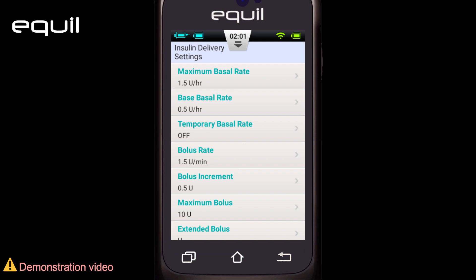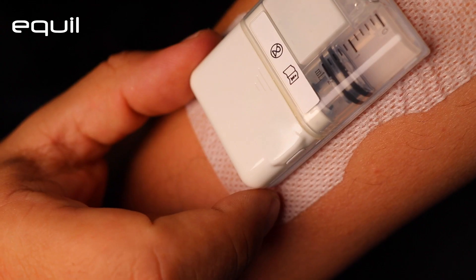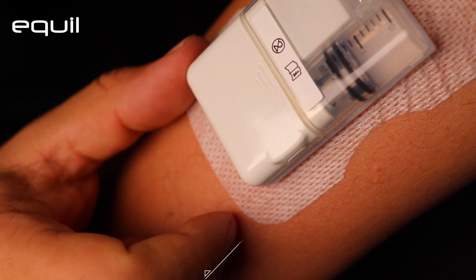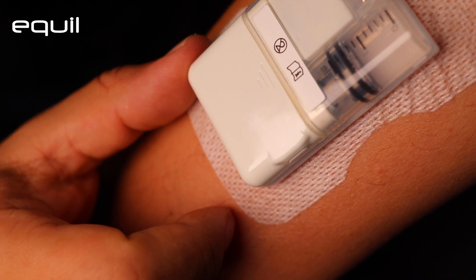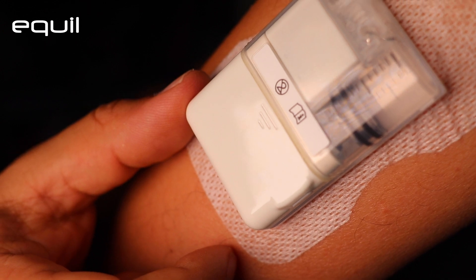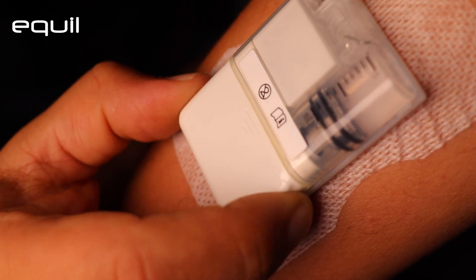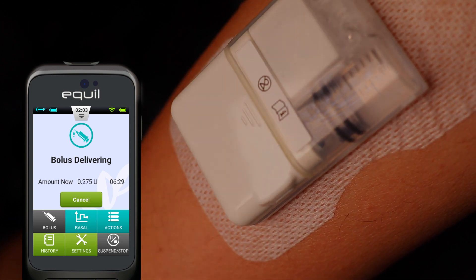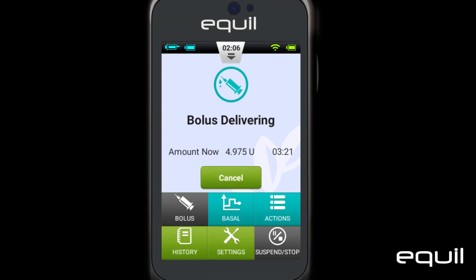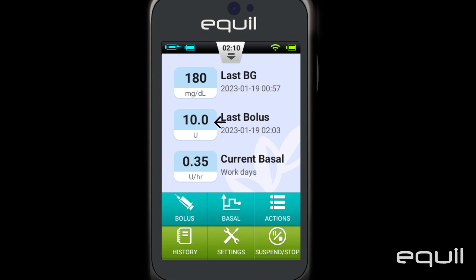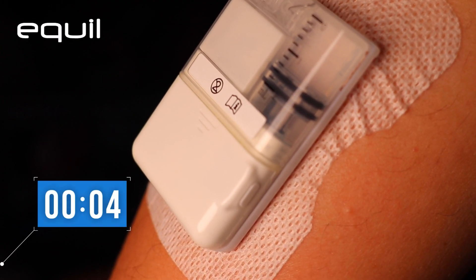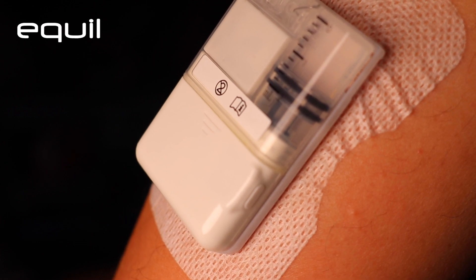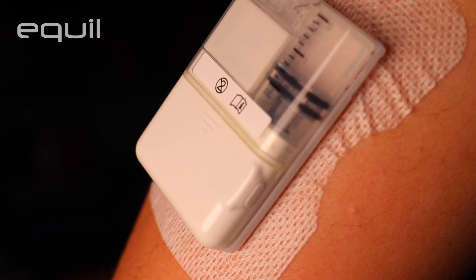Note: the maximum quick bolus dose cannot exceed the pre-adjusted maximum bolus setting. Once you've determined the right bolus dose, wait 3 seconds. The pump will play audible tones back to confirm the bolus amount. If the number is correct, press the button one last time and the pump will start administering the bolus. If the number of tones is incorrect, wait more than 10 seconds and the pump will give an audible alert that the quick bolus has been cancelled.